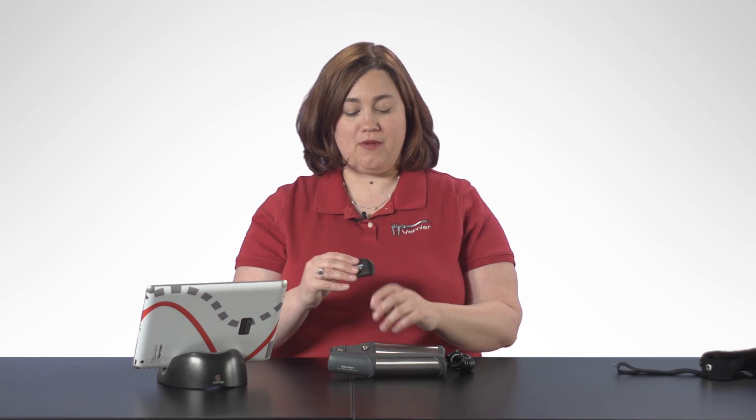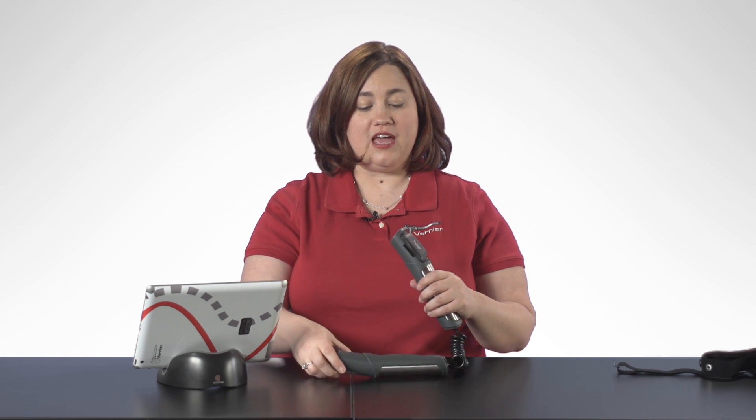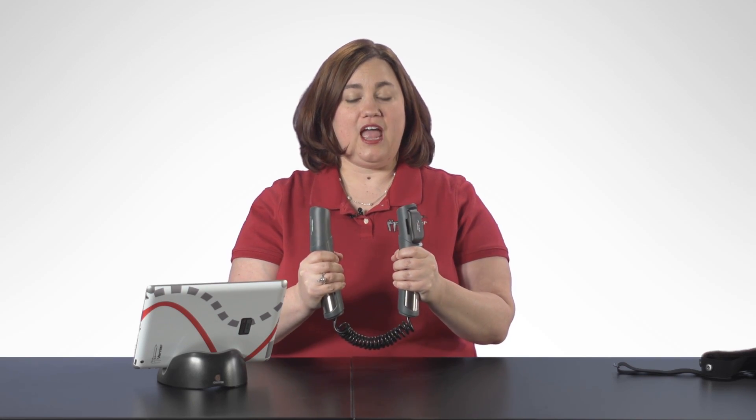In order to collect data, first I want to make sure my module is connected to the hand grips. Then I want to take my Go Wireless Heart Rate and hold it in my hands in order to turn it on. I want to make sure that the metal part is towards the palm of my hands, and make sure that I'm holding on to it because this is how the sensor actually turns on.